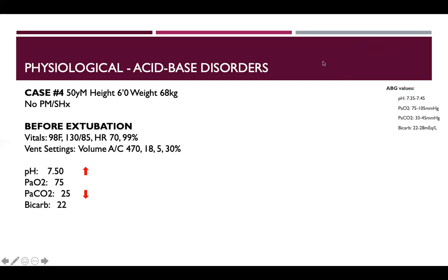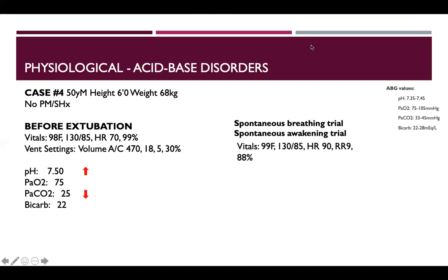So they're becoming alkalotic. And what we do is each day we do something called a spontaneous breathing trial and a spontaneous awakening trial. So we go light on the ventilation settings, see how the patient does. And also, because many of these patients are in sedation, we lighten up on the sedation as well, so that you can really see how the patient is doing without all these extra components that we've added to their care. So let's say we do that for the patient.